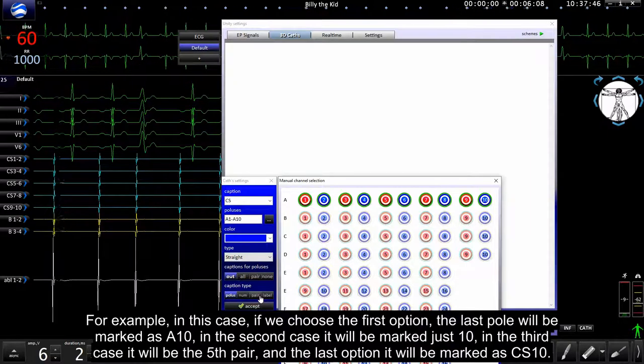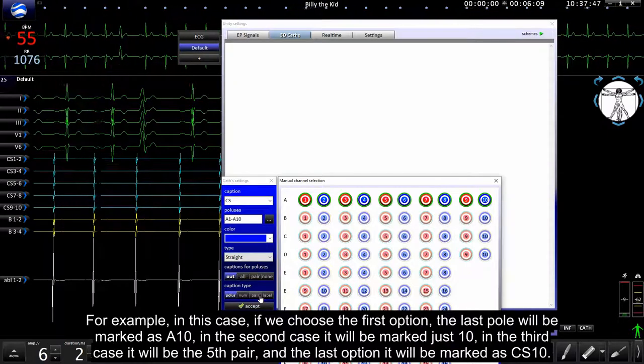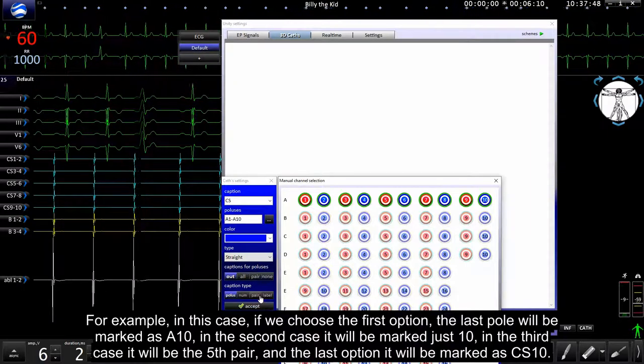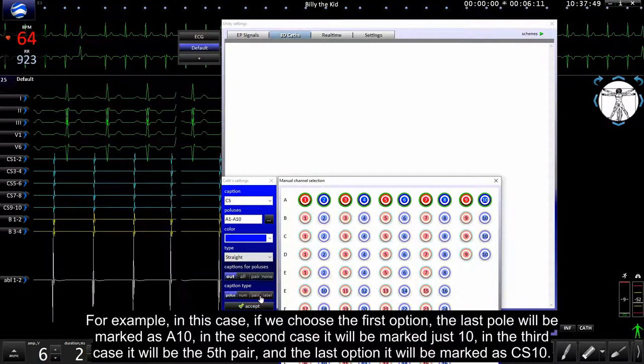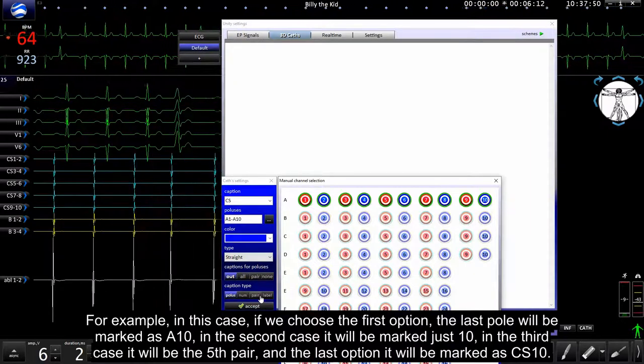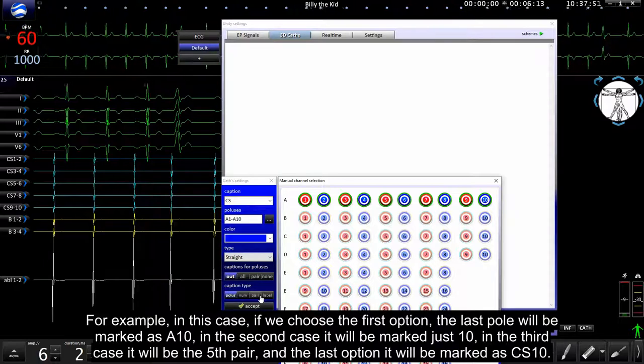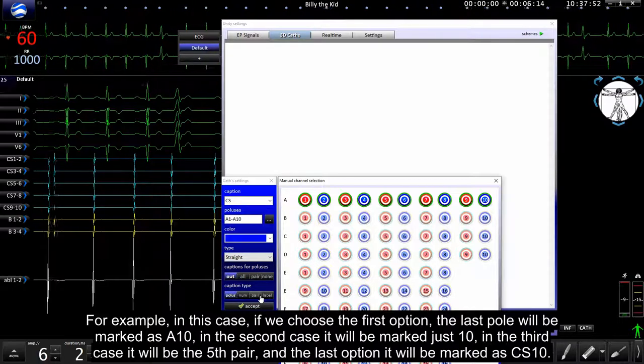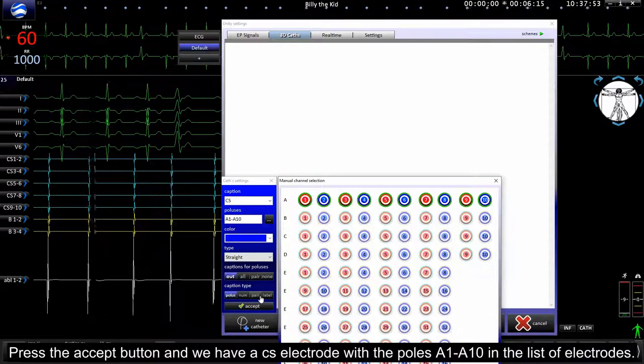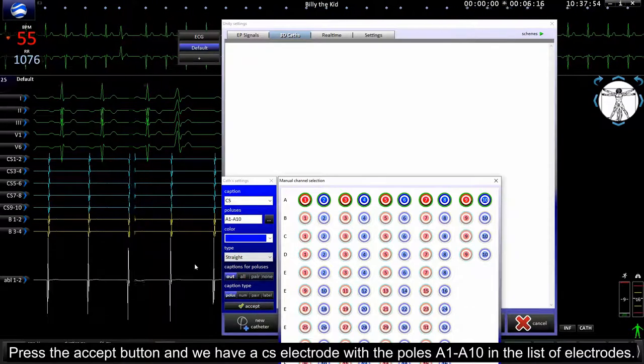In the third case it will be 5th pair, and at the last option it will be marked as CS10. Press accept.